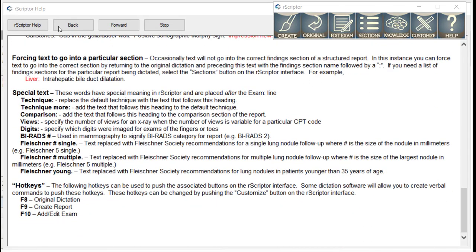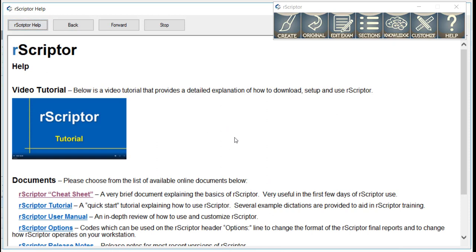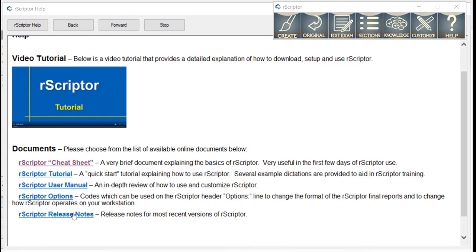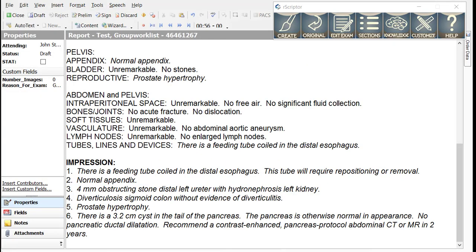There's also additional information available in the Help section including a written tutorial, a user manual, options which describe how to change the options line in R-Scripter, and releases of R-Scripter and the changes which occurred with each release. Let's return to the dictation window and the original report.